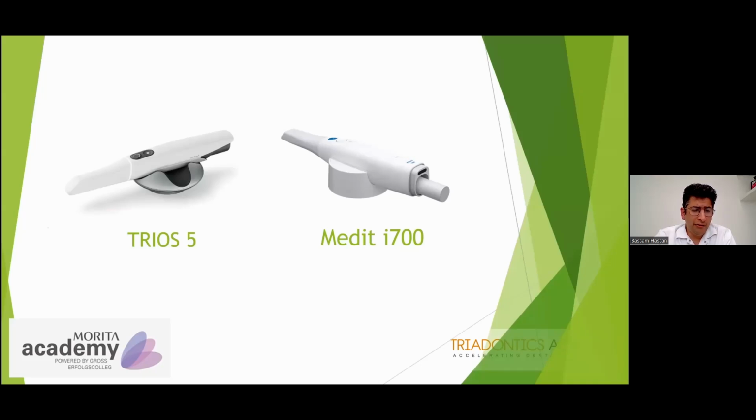And I didn't really pay much attention to the evolution of the 3Shape scanner because the workflow was a little bit closed for my liking, and really geared towards working with the 3Shape design software, which I didn't work with because I was an ExoCAD user.